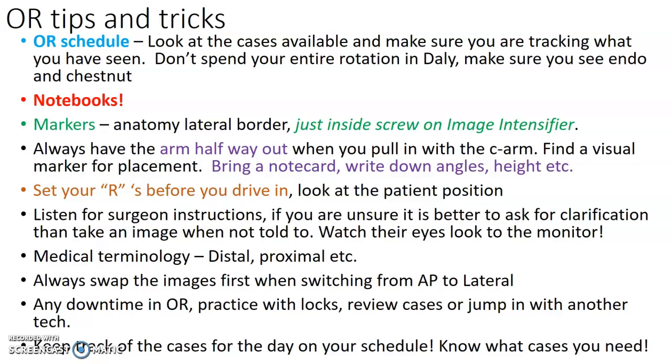Any downtime in the OR, take advantage of it. Practice with the locks. Set up the C-arm in a room. Review your cases. Jump in with another tech. Always be looking at that schedule. When you come out from a case, if nothing's happened, look at that schedule and say, oh, Deb is in room 9. No, there's no student with her. I'm going to hop in with her there. Keep moving. See everything that you can see. Keep track of the cases. Write it down in your binder. Know what you need to know.